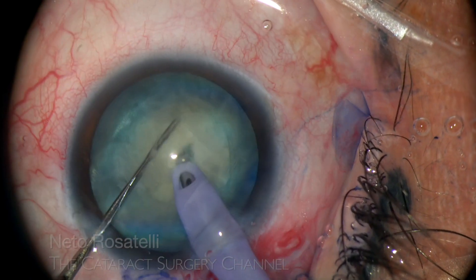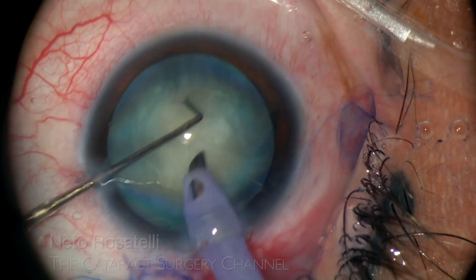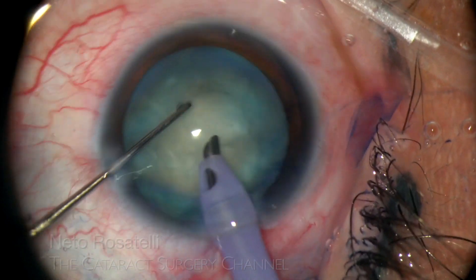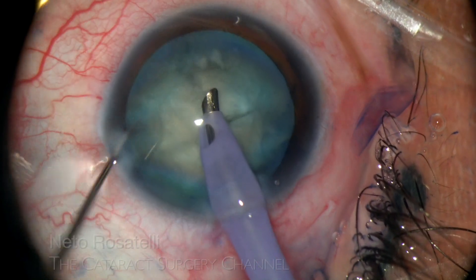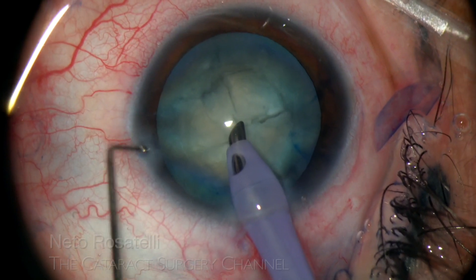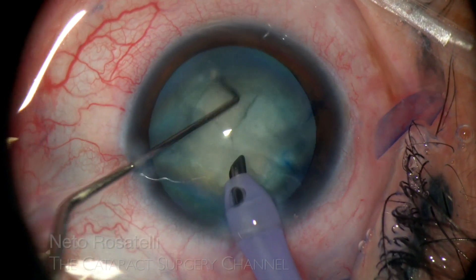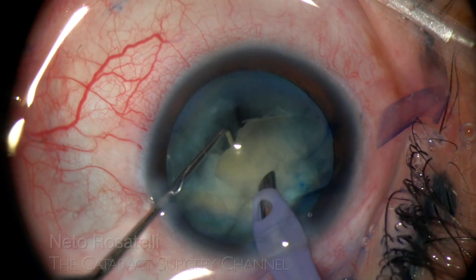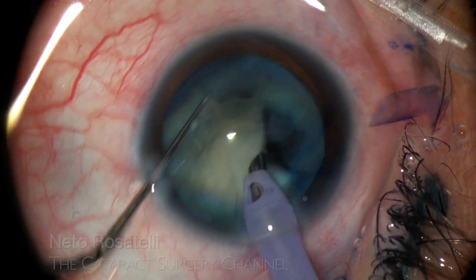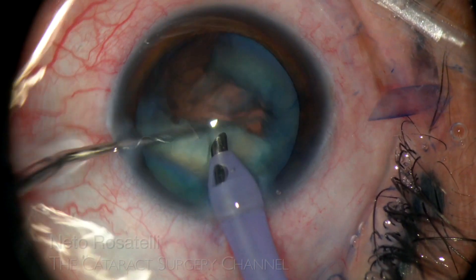The nucleus is quickly divided using the wedge mechanical fracturing technique. No ultrasound power or vacuum used until here, showing the efficiency and safety of this technique. Just use the bevel of the tip against the chopper-stabilized nucleus. The quadrants can then be easily emulsified, as in this case.